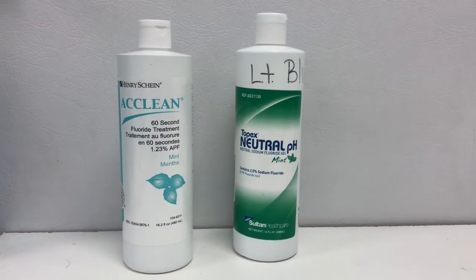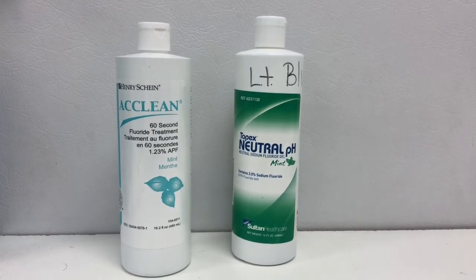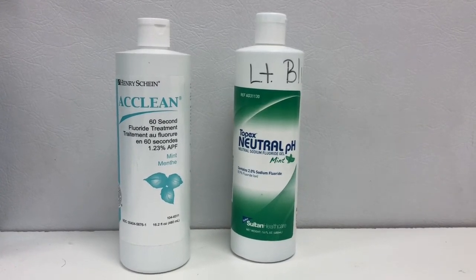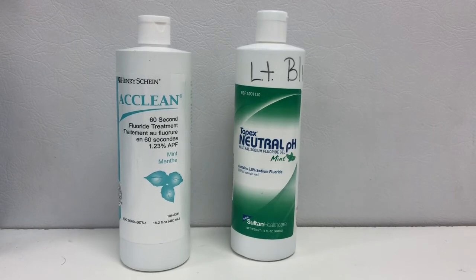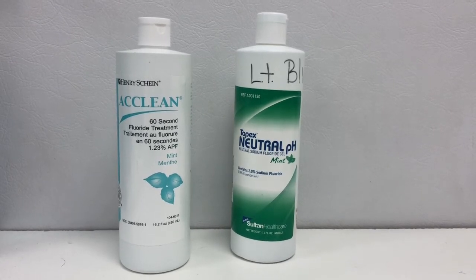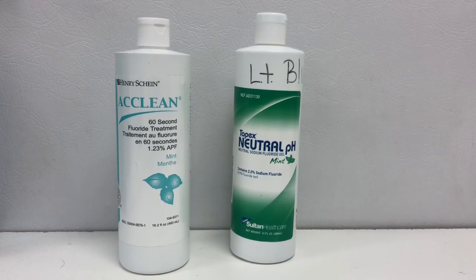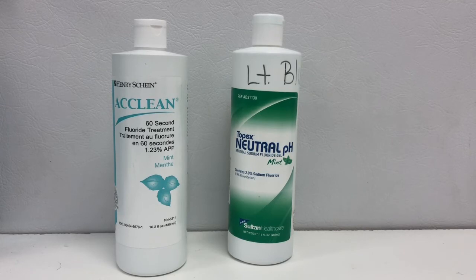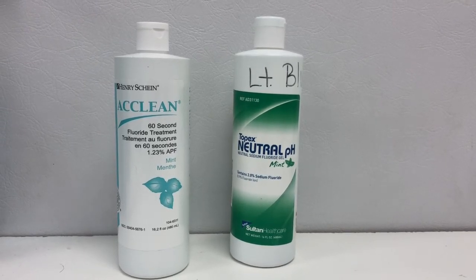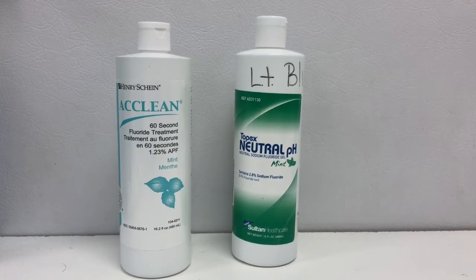Here we have the two different types of gel, and you'll want to select the correct one depending on the patient's needs. On the left we have the APF — you do not want to use that on sealants or if the patient has composite or porcelain restorations, as it is a little more acidic and can etch the porcelain. On the right we have our neutral sodium fluoride, which is okay to use if a patient does have sealants or composite or porcelain restorations. Depending on what the patient needs, you'll want to select the appropriate fluoride gel.